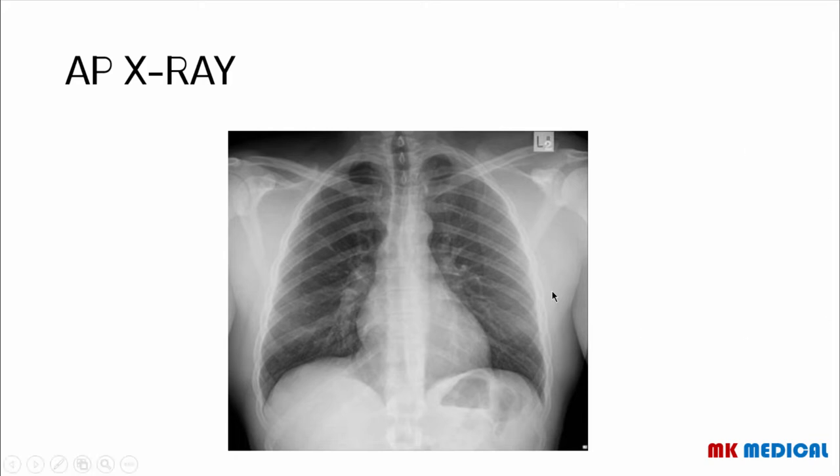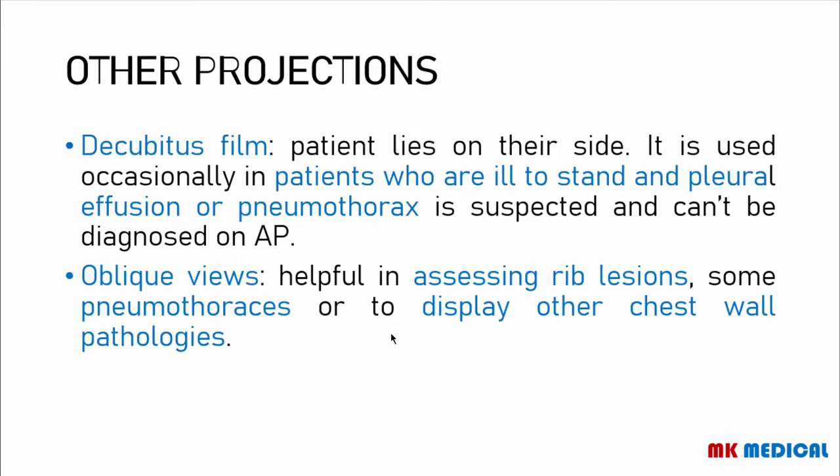So as we can see here, the heart appears much larger. Even generally, the entire mediastinum here appears much, much larger than it was in the posterior anterior X-ray.